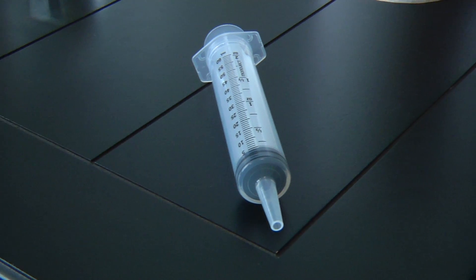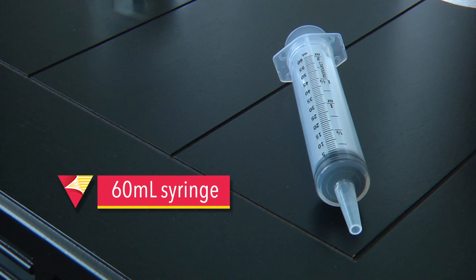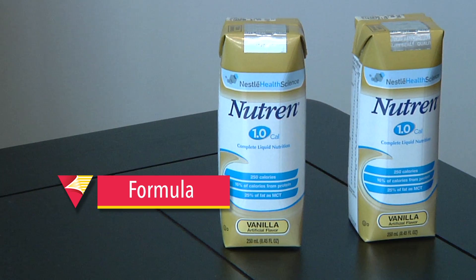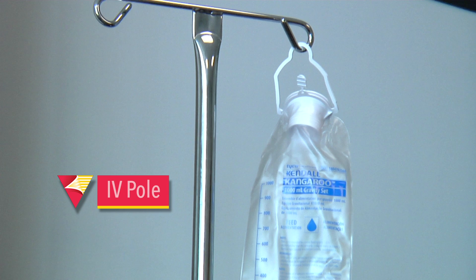To gravity feed you will need a 60 milliliter catheter tip or oral syringe, a cup of room temperature water, formula, a gravity feeding bag, and an IV pole.